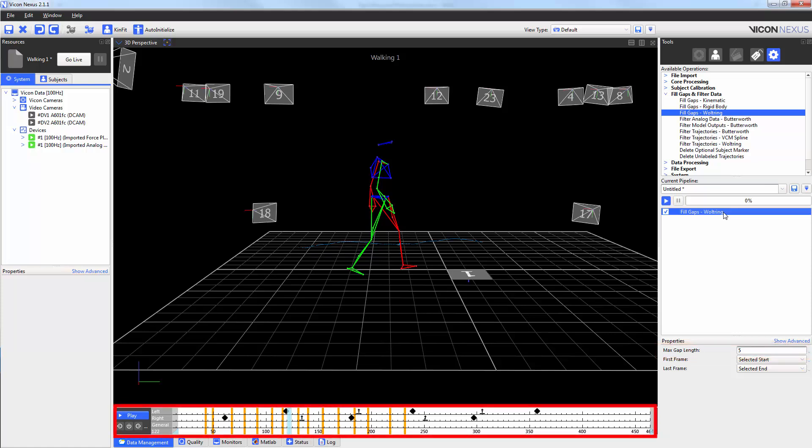Also in this example, we can see that there are numerous small gaps in the marker that I've selected. By hitting play, we can see that those gaps now disappear.